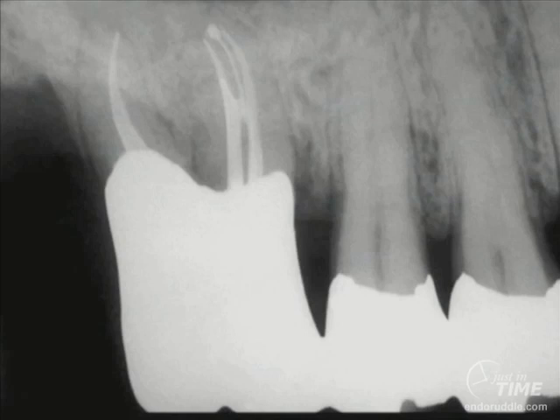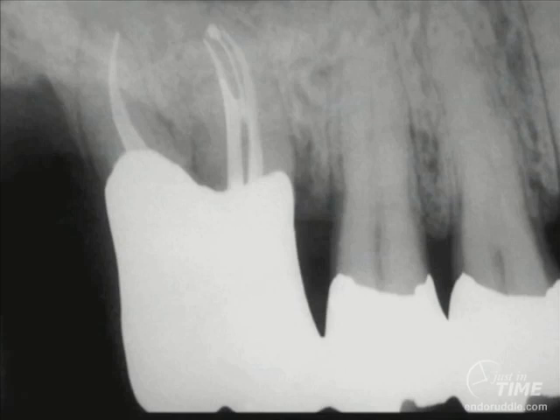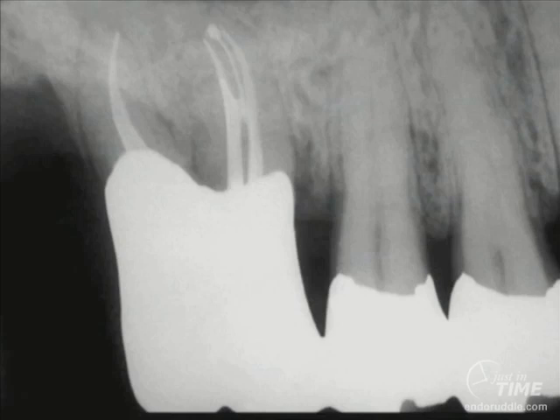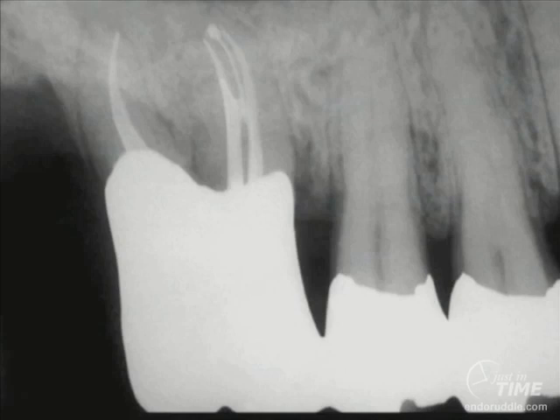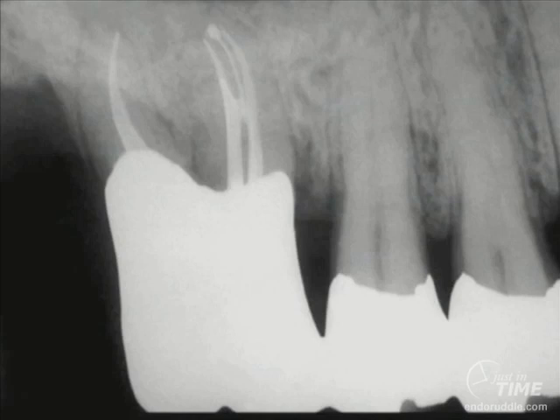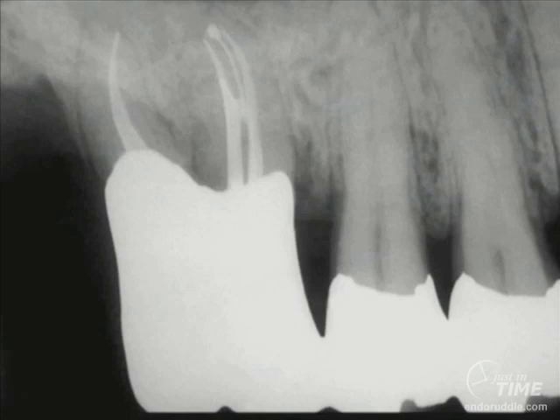The tooth has had endo, perio, and prosthetics, and the palatal root has been amputated. Notice the buccal systems. I want to bring your attention specifically to the mesial buccal root. Notice within the MB1 and MB2 at mid-root there's an anastomosing, and within that anastomosis there's another canal that has its own length and terminal portal of exit. When we can do endodontics like this, when it's properly performed, it is actually the cornerstone of restorative and reconstructive dentistry. These kinds of results are exciting.